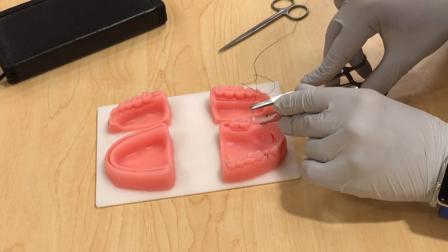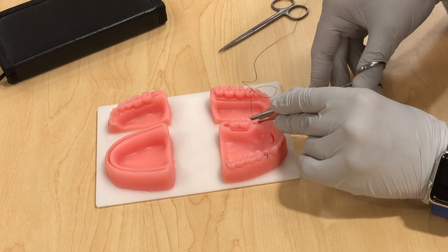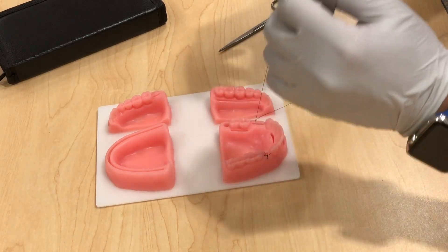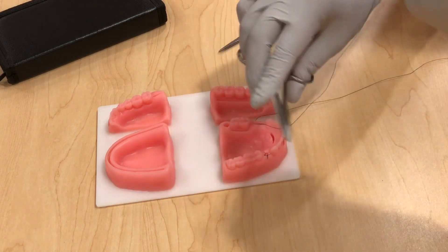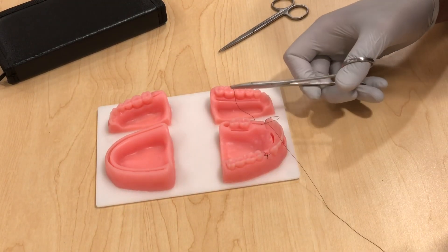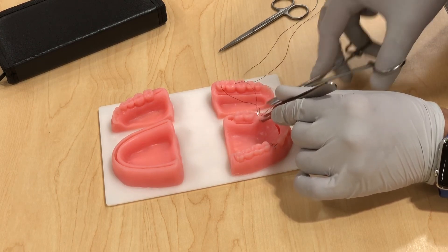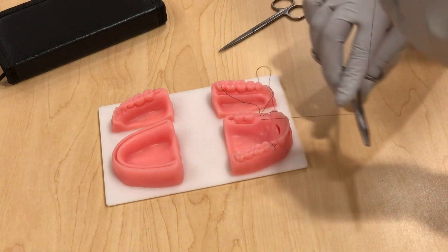Grab your tissue and rotate your arm — do not push it, just rotate it and it will do its job. Instead of pulling all the way through and potentially hitting someone, you can place an instrument and then just pull it like that. Be careful not to lose your short tail. Always go at 90 degrees and 1.5 to 2 millimeters from the incision.